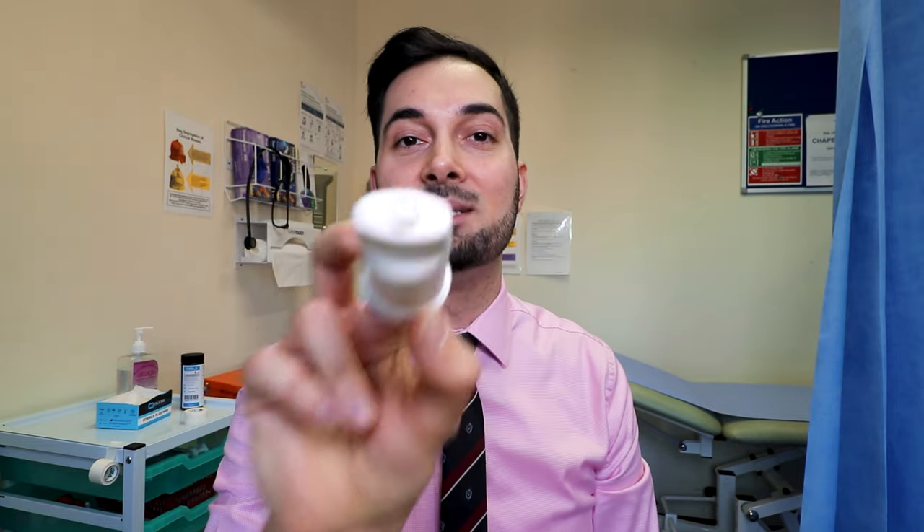Always hold the turbohaler upright — never on its side. Before you take any dose, after you've taken off the cap, always have a quick look in the hole in the mouthpiece to make sure there's no dust, no foreign bodies, nothing in there, because we don't want to get anything going down into our lungs.